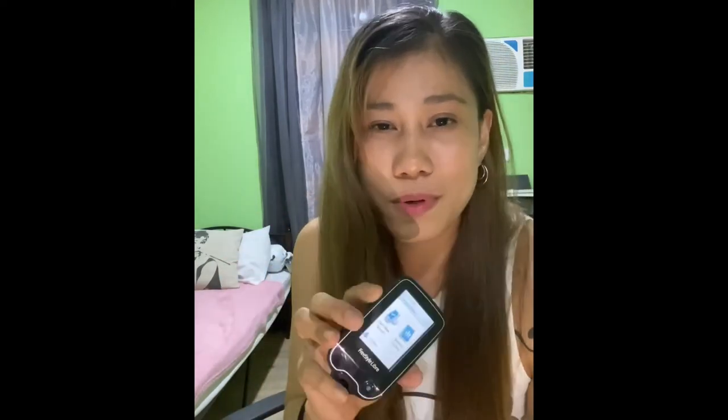I decided to vlog this because the first one kind of freaked me out. It has a needle that's medyo thick and medyo mahaba compared to the needle I use for my insulin shots.